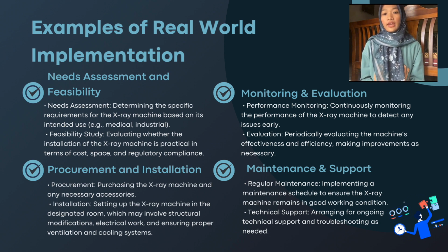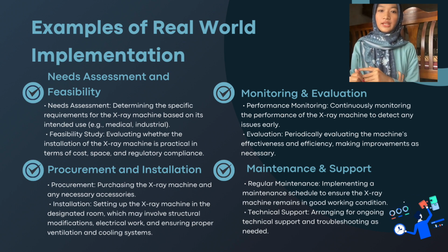Secondly, monitoring and evaluation. Once our X-ray machine is all set up and running smoothly, we're not just going to forget about it. We're going to keep a close eye on it to make sure it's doing its job right. We'll keep track of how often it's being used, if it's making any mistakes, and if it needs any fixing up. And every now and then, we'll do a big checkup to see how well it's doing overall. This way, we can make sure our machine is always in top shape and ready to help us whenever we need it. Thirdly, procurement and installation.